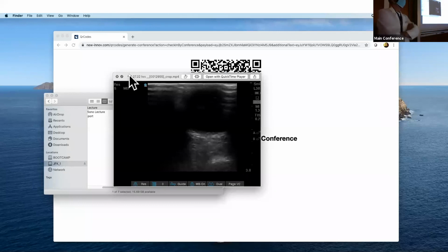A patient who is on doxycycline and now has tunnel vision, can we effectively use this as a way of saying, well, this is not the doxy-induced intracranial hypertension? I don't have to go down the route of LPing this kid. There could be some value to that.